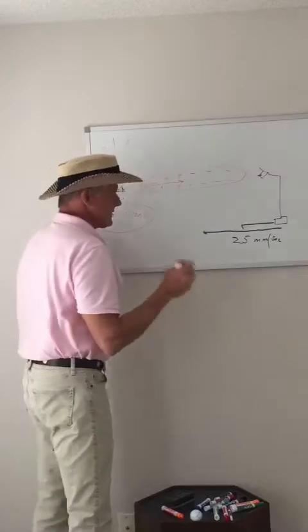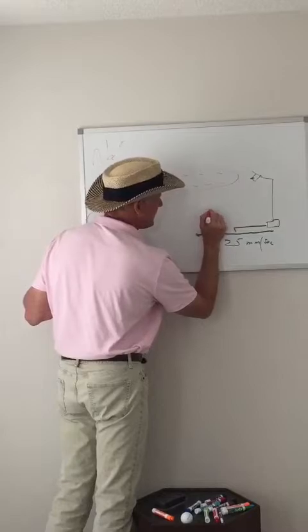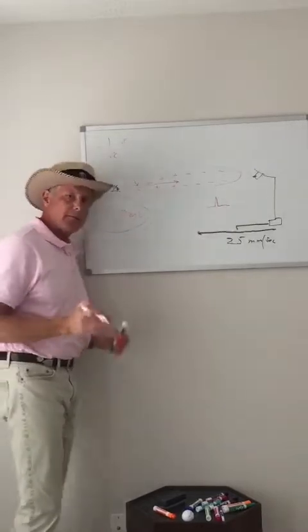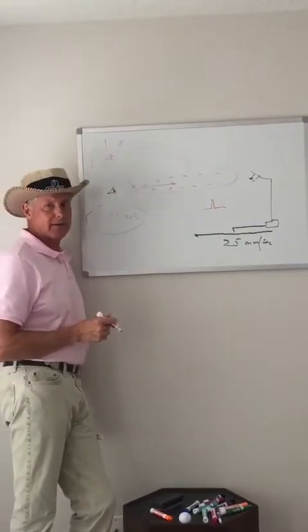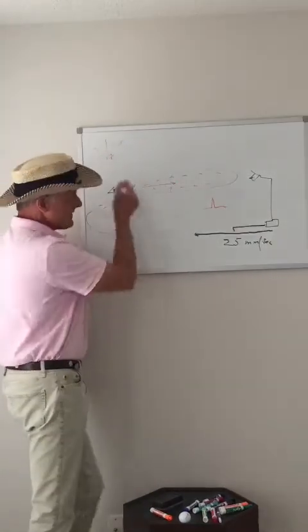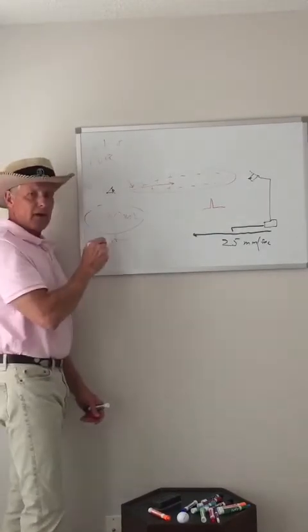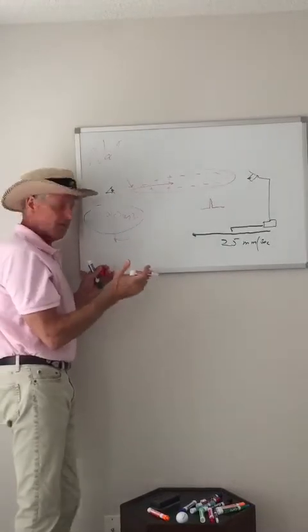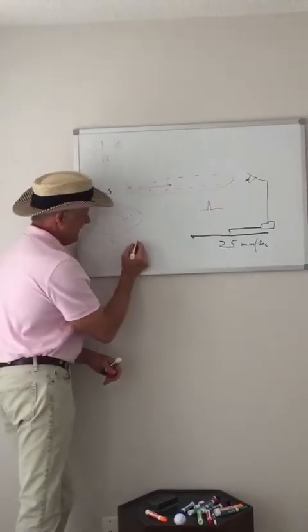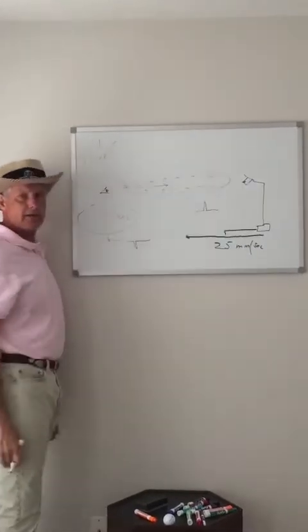This eyeball being located over here will see a wave of depolarization moving towards it. That's critical. So the person that designed the EKG machine said, okay, if this eyeball sees a wave of depolarization moving towards it, it will inscribe on the paper a positive or upright deflection. Well, that's fine. That's by convention and design. So what about this eyeball? This eyeball is hooked up as well. And this eyeball, looking at the same piece of heart tissue, sees a wave of depolarization moving away from it, and it is designed to inscribe a negative deflection or a downgoing deflection.